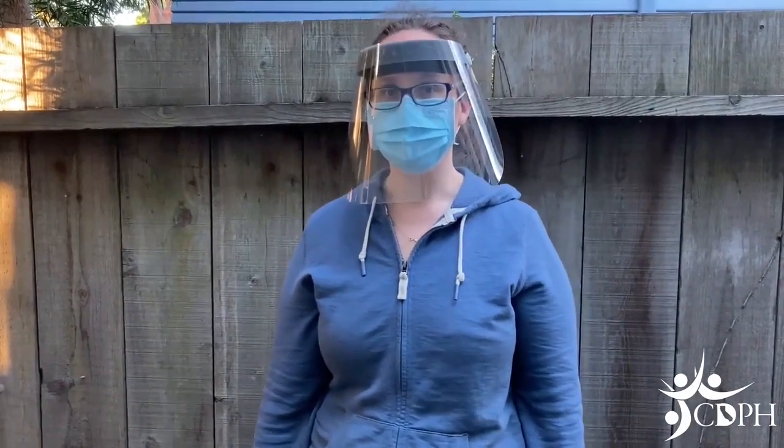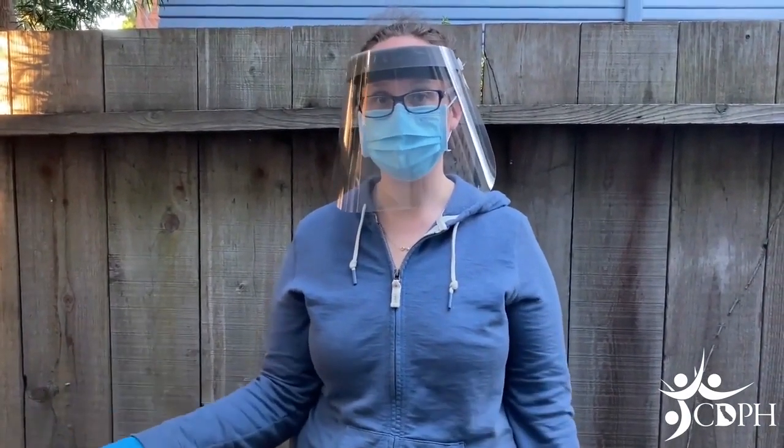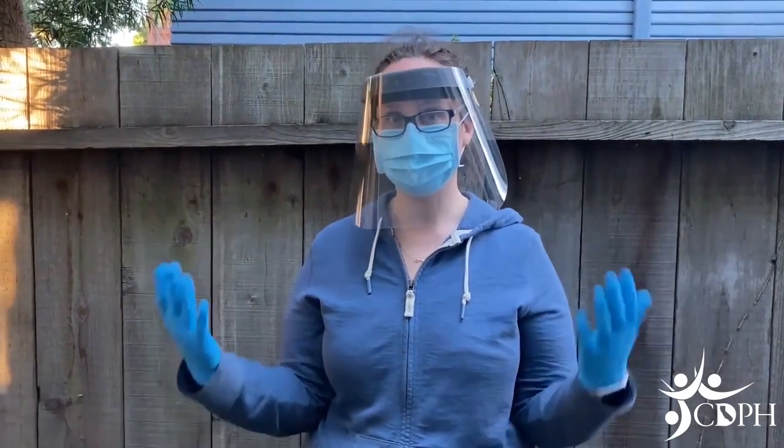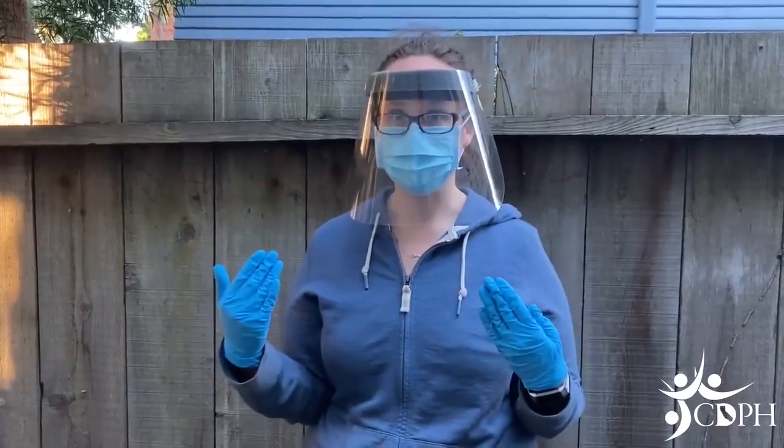This video demonstrates an anterior nasal swab test and was made to help instruct students to do this test on their own, to self-swab. To protect myself, the protective equipment or PPE I need are gloves, optional but recommended eye protection such as goggles or face shield, and a mask.